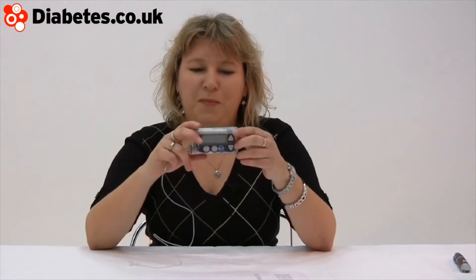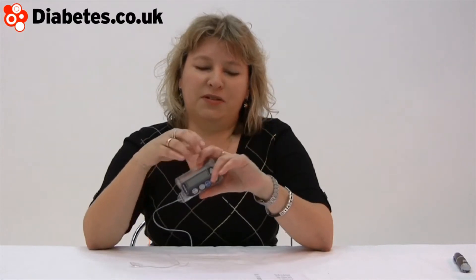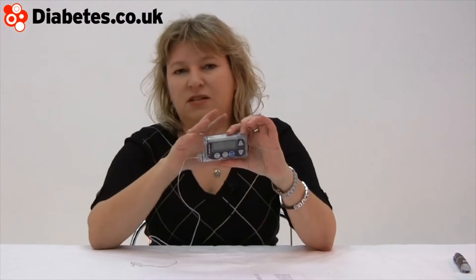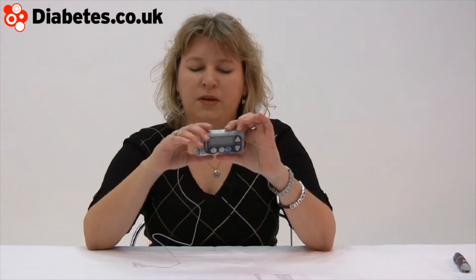It gives you what they call the basal rate — your base rate — and you end up having to discover your own needs on a sort of day or night basis. I take really small amounts of insulin. I'm on about half a unit an hour, which is like 12 units a day, which is very modest indeed. Other people would be on different measurements, and nobody really knows why. It's not necessarily to do with body mass or anything else.